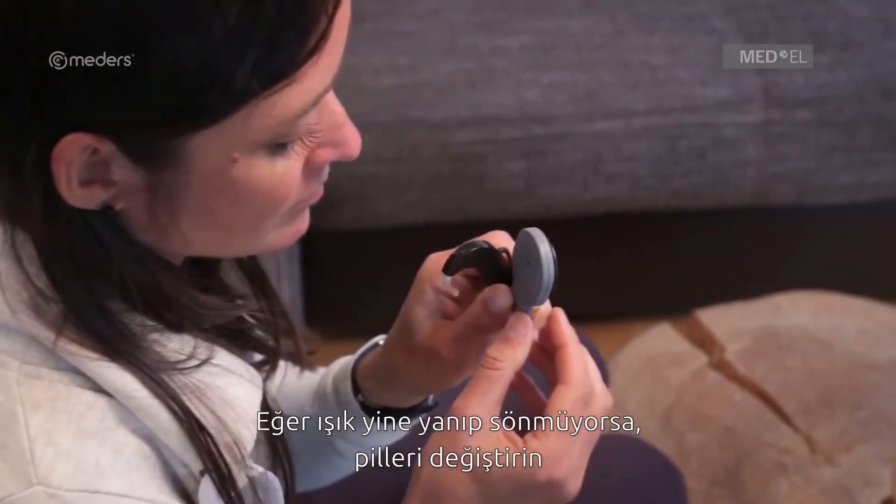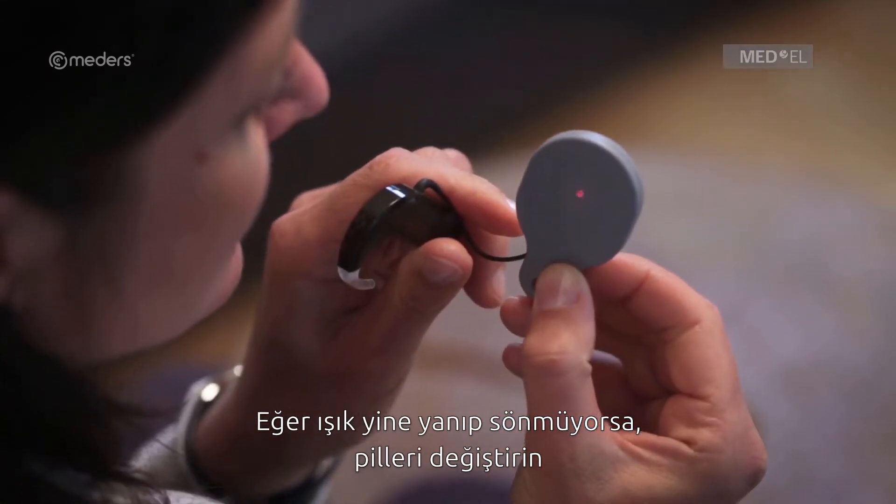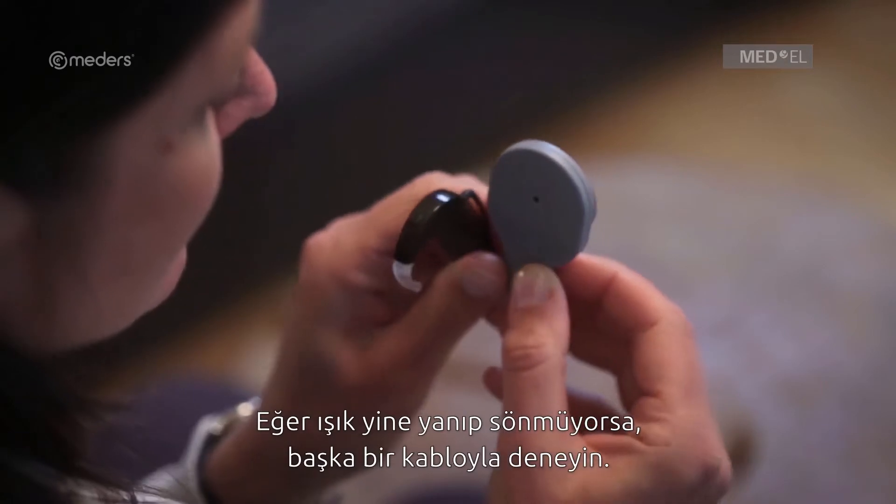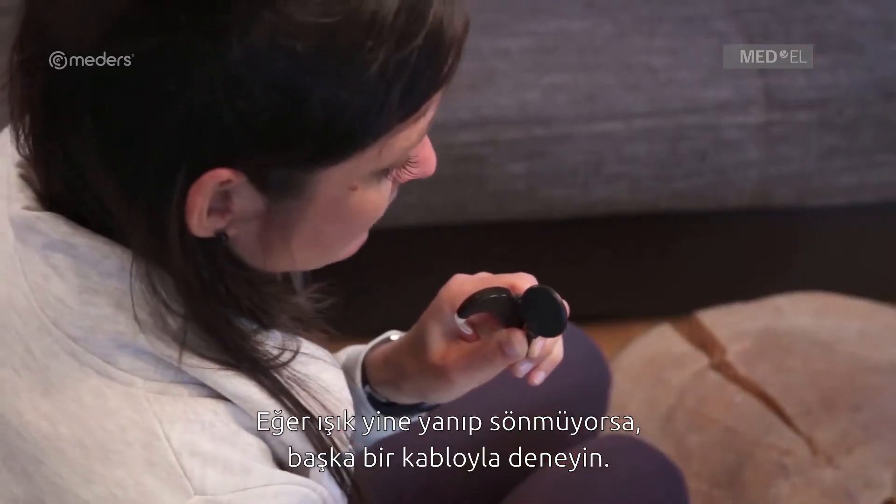If the indicator light still doesn't flicker, change the batteries and speak into the microphones. If the indicator light still doesn't flicker, replace the coil cable.